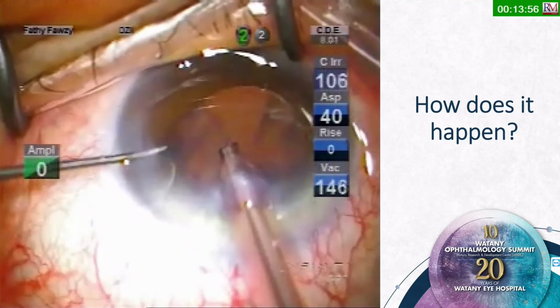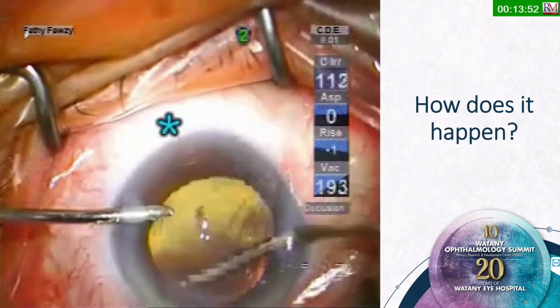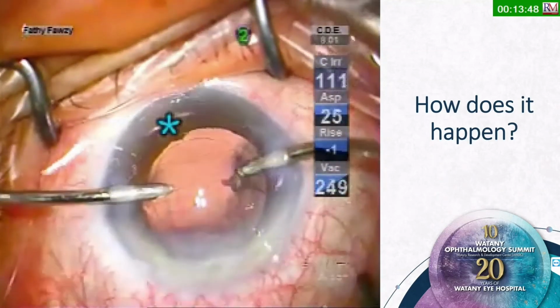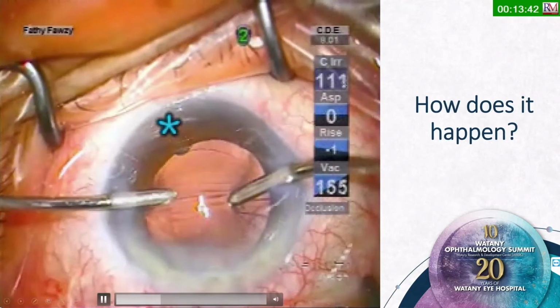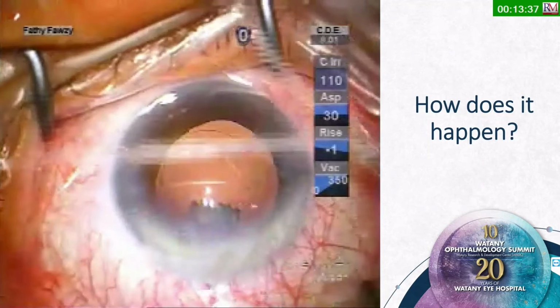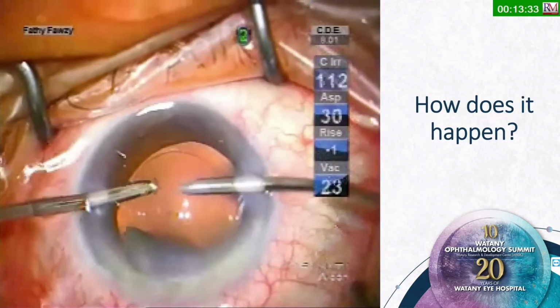This is the case where the fragment disappeared. I reviewed the surgery. The surgery looked straightforward. But here at the side of the asterisk, you see that this portion of the fragment is showing at the sulcus. How did it go into the sulcus?